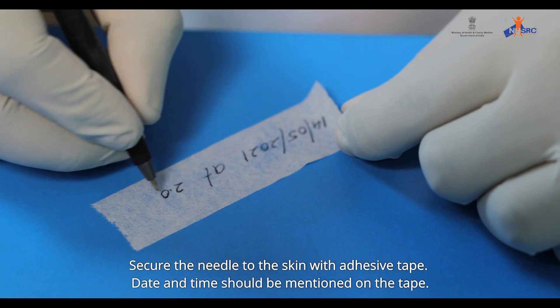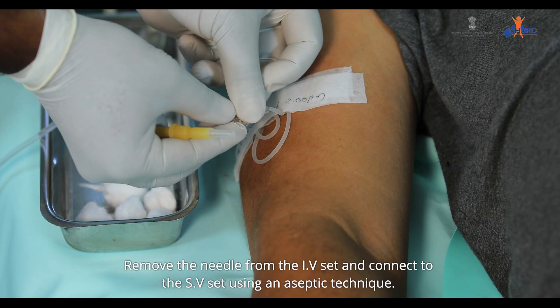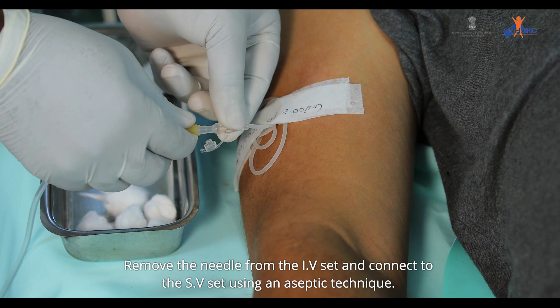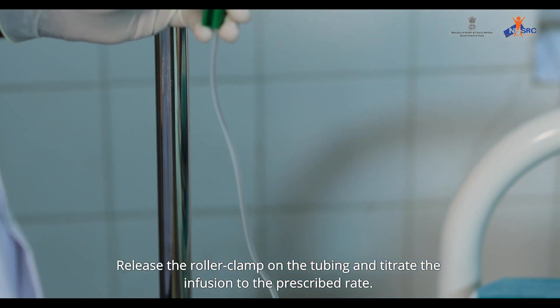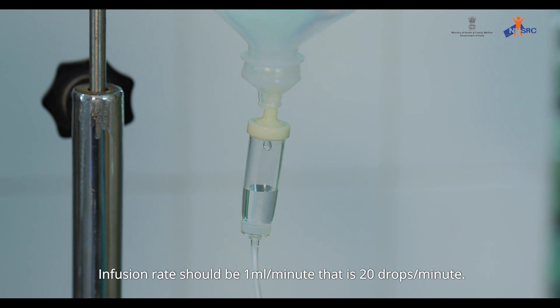Secure the needle to the skin with adhesive tape. Date and time should be mentioned on the tape. Remove the needle from the IV set and connect to the scalp vein set using an aseptic technique. Release the roller clamp on the tubing and titrate the infusion to the prescribed rate. The infusion rate should be 1 ml per minute, i.e., 20 drops per minute.